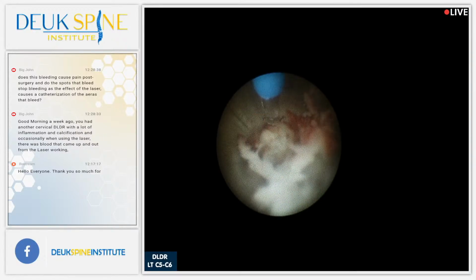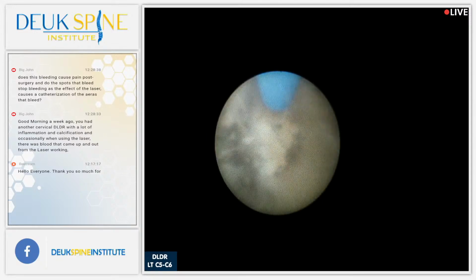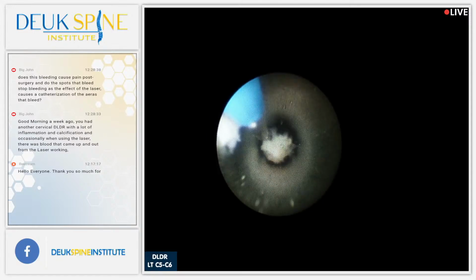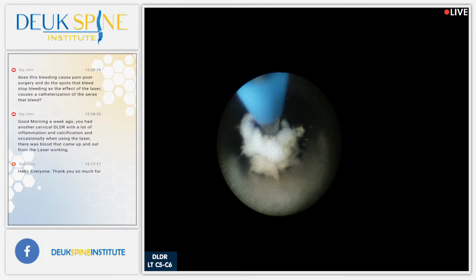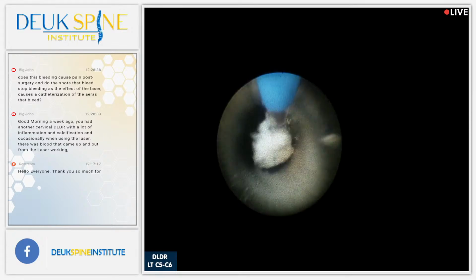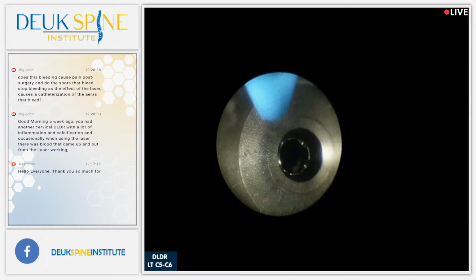Now we're going to go in. You guys see the inflammatory tissue, the red stuff? That's all inflammation. That's why we're here. Look at this piece right here. Check out the pink color. You guys see it at the bottom? Like right there? Yes, we do. That's inflammatory tissue. That's what's causing all of his pain. The tear is inflamed.